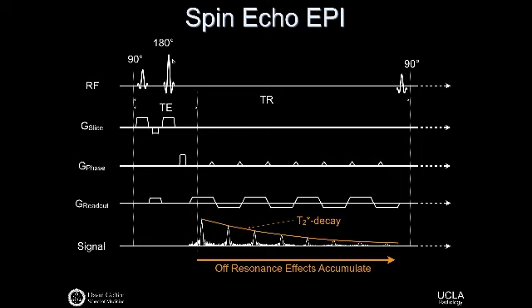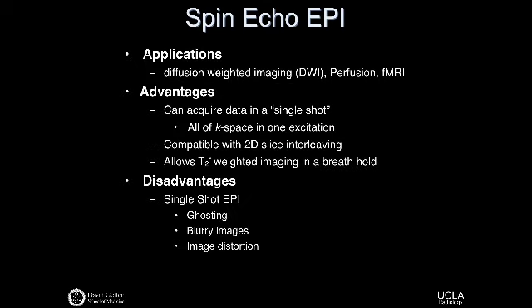So again, it's a mix of a spin echo and a bunch of gradient echoes, such that we're getting dozens of echoes in a pretty short period of time. And this is a really pretty widely used sequence for different protocols because it has such fast scan capabilities.